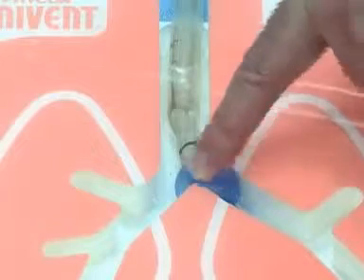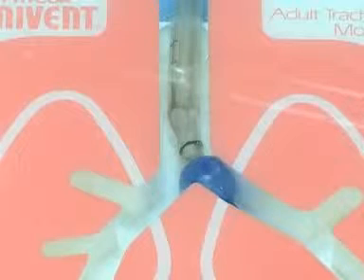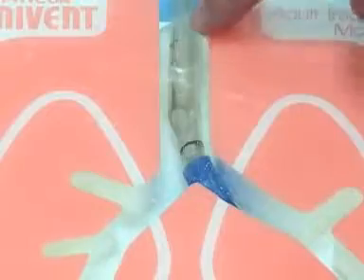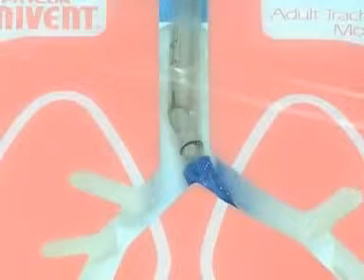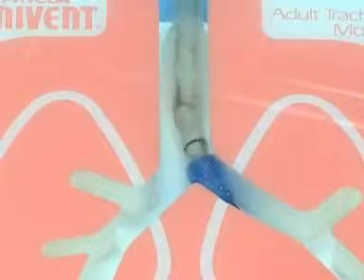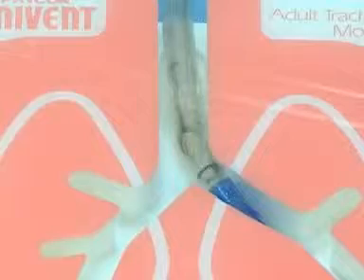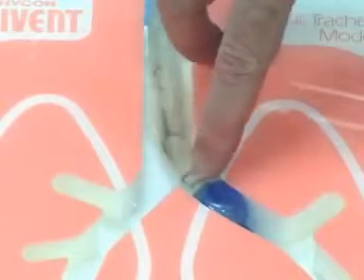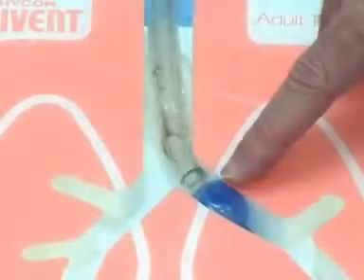If the balloon herniates over the carina — you can see the carina, then inflate and it herniates over — that tells you you need to advance it just a little bit more. Every time you advance or pull it back, make sure you deflate the tracheal cuff first, because this is pseudocolumnar ciliated epithelium and dragging the cuff will give the patient a very sore throat. Deflate, advance to just the right spot, reinflate. Now you see the carina and just a little tiny crescent of blue — that tells you you're in the right place.